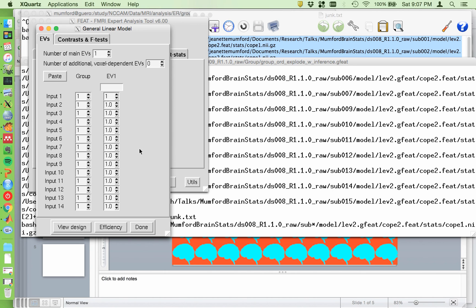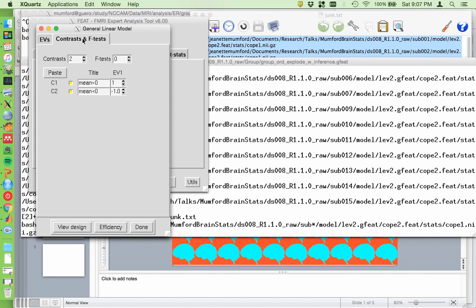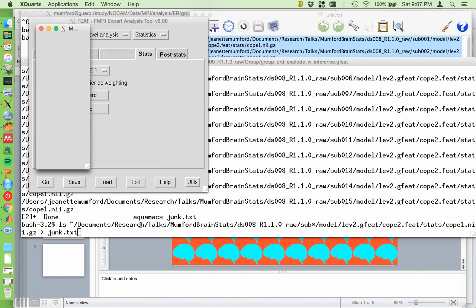And my group level analysis is just a one sample t-test. So I have a column of ones. And I have two contrasts, one to test the mean greater than zero, and one to test the mean less than zero. So that's done. Design matrix looks good.